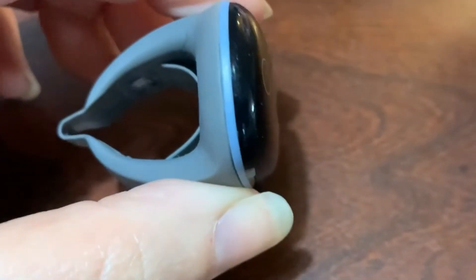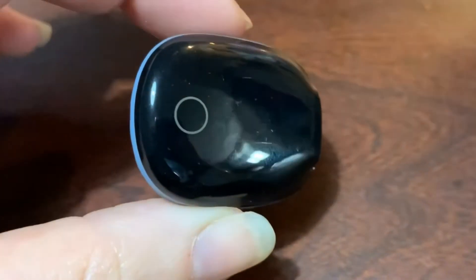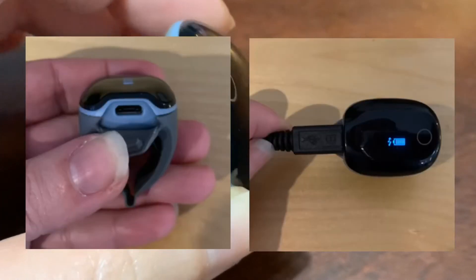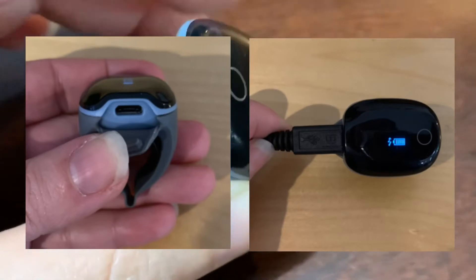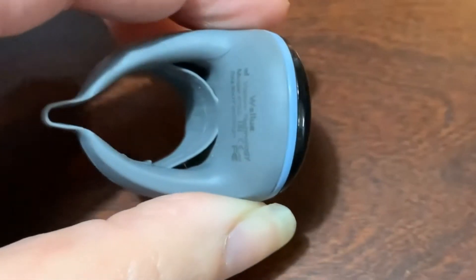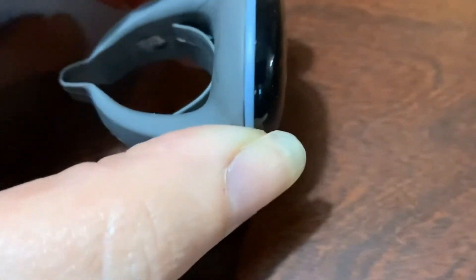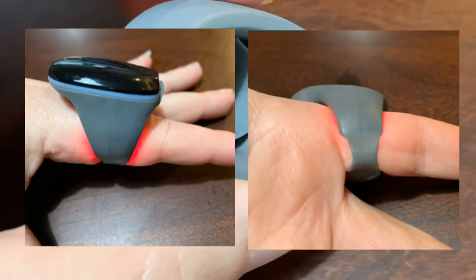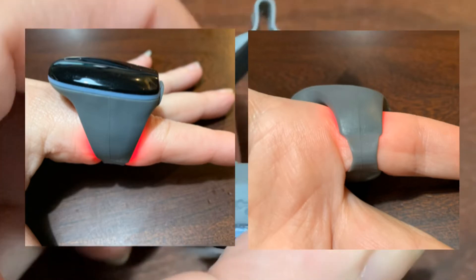The battery on this lasts around 14 hours or so, so you're going to want to charge it every other day at the very least if you want to use it for a night's sleep. If you're just using it to test oxygen throughout the day then it doesn't matter as much. It's comfortable when you wear it and it's a flexible silicone, as you can see here.